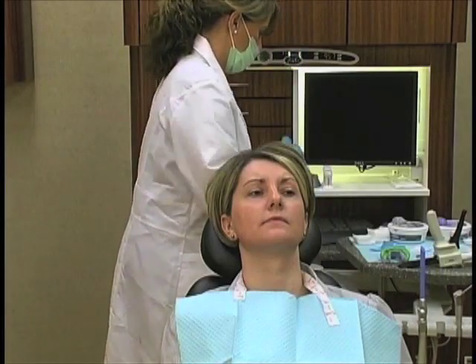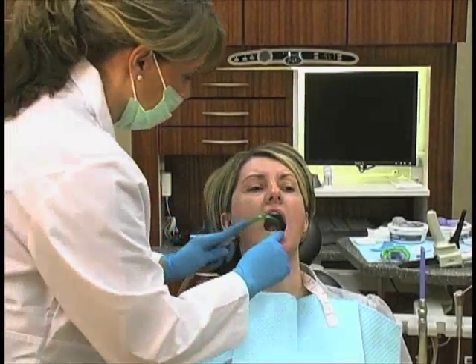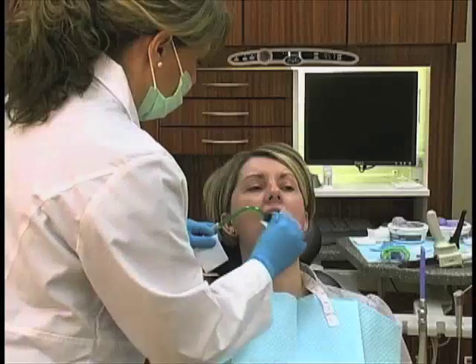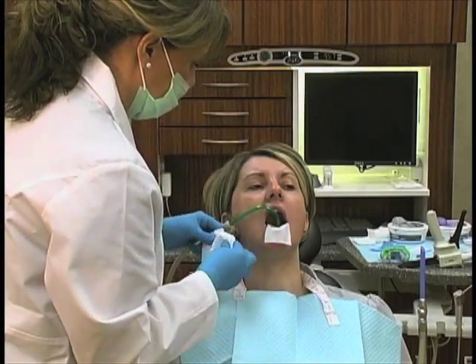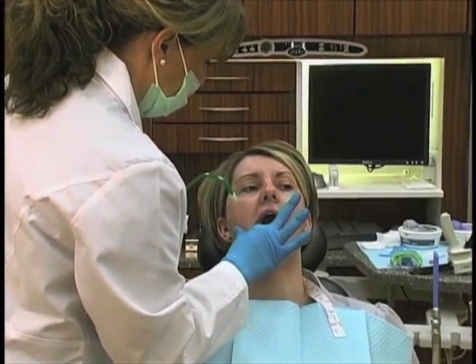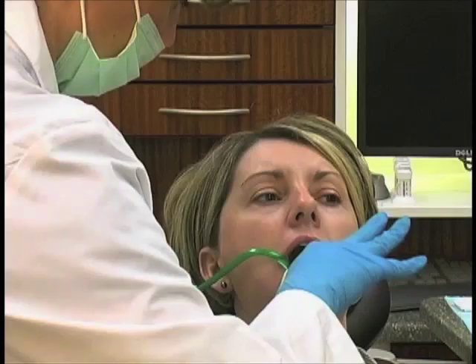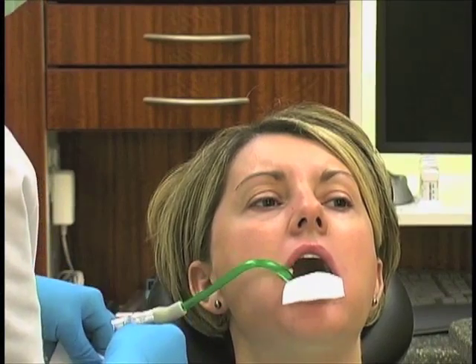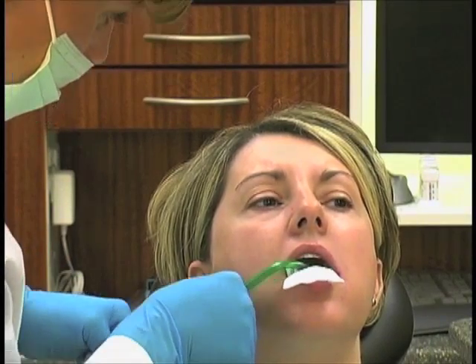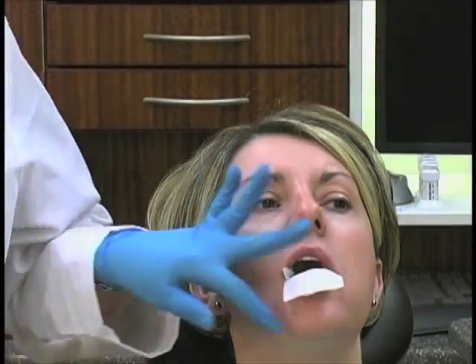Now she's going to go back to the mouth. And the first thing we've got to do, let that tray sit there. She's just going to dry the teeth, because remember, with polyvinyl materials, you just don't want to have fluid. And this is where we get the real accuracy on the occlusal surfaces. Because she's just going to dry it, leave a little 2x2 sitting there right on top of the teeth. Little saliva ejector in there. And now she can get the tray. Come back to the mouth.